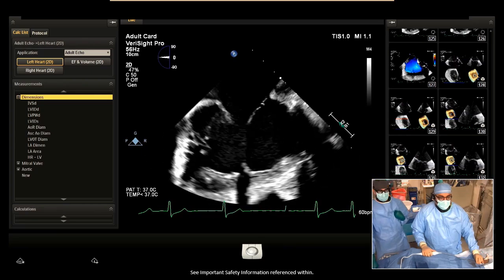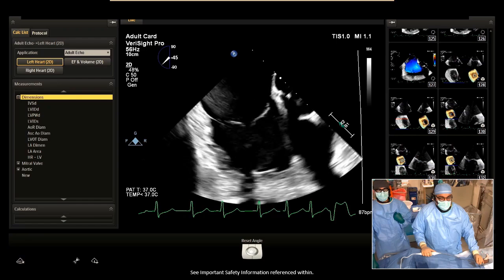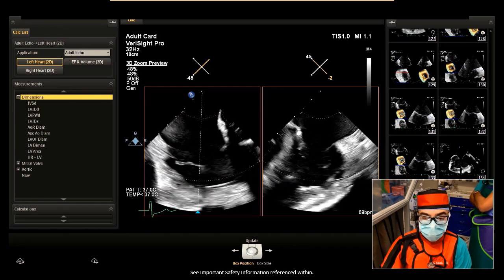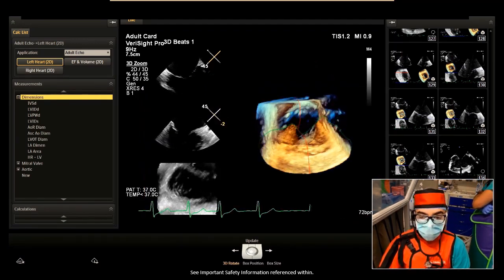Edris, why don't you switch to -45? We're at -45 now. Good. And then why don't you go ahead and build me a 3D nav map? Okay, one moment. It's going to come up here. You'll see your 3D nav map in a moment. I'm rotating down here.